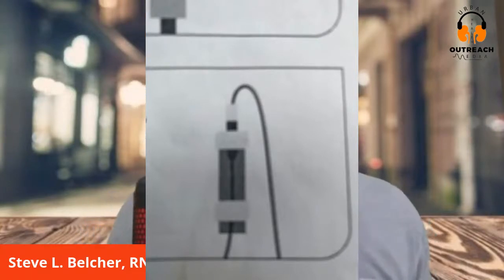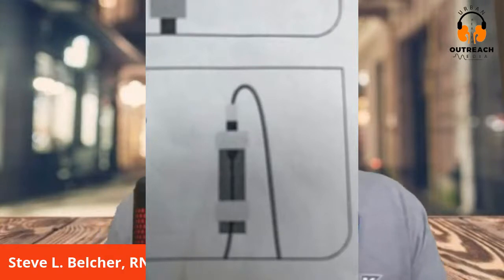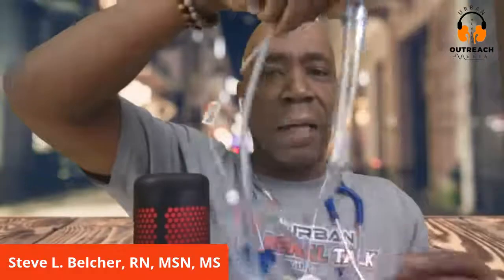And I've seen people's lines with air in them, and the lines end up clotting because there was so much air, they tried to get it out and they couldn't, and it clotted the system. Now, let me show you what a real one looks like.